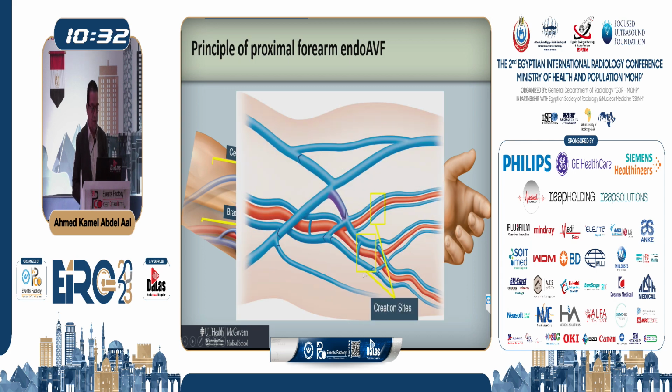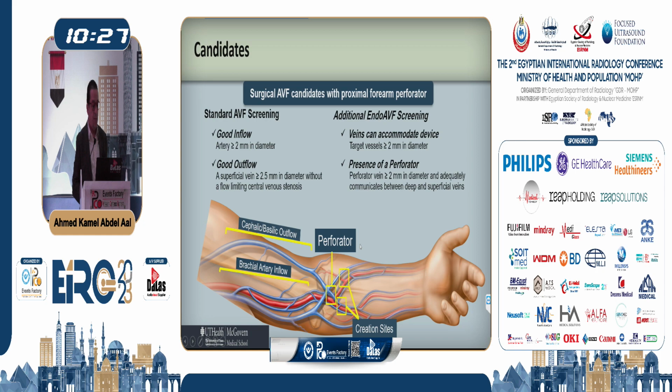This is again a close-up. Here is where we create the fistula. Here is the perforator that should be present in these patients. Patient selection is very easy.